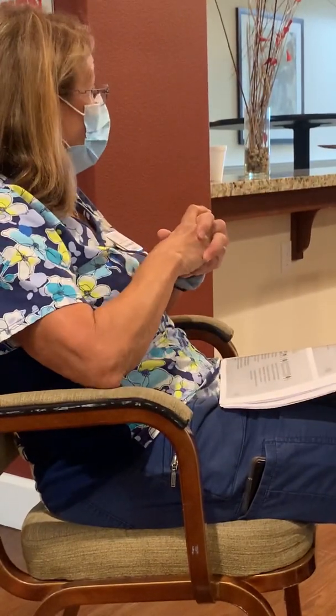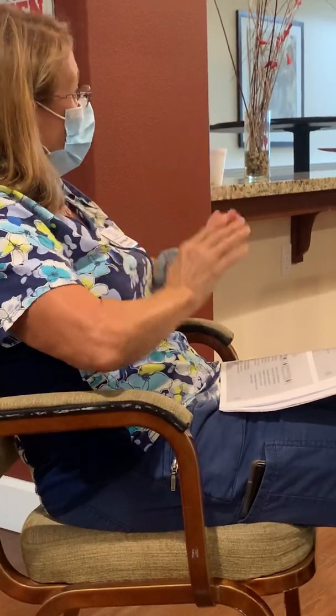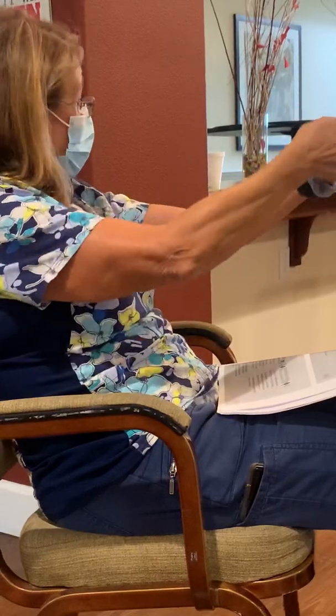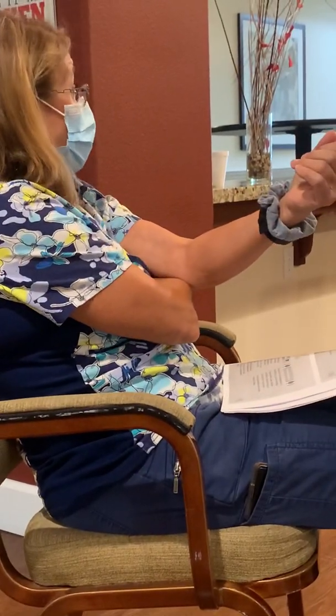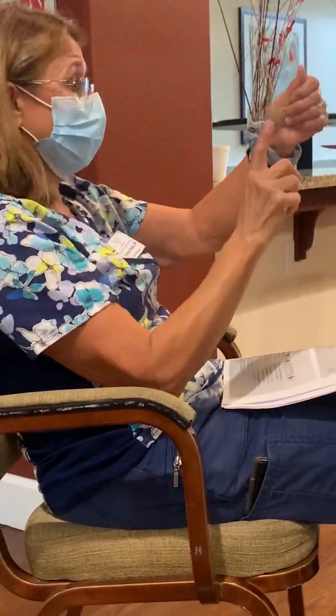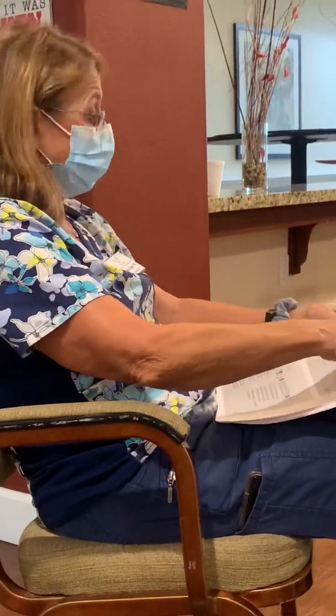Now for a woman, we're gonna clean the perineal area. You're gonna start at the top and work down towards the bottom. You're gonna start at the catheter again, work down towards the end of the tubing. So again, same with the man, do the tubing and down that way in a circular motion all the way down, and then cleaning the perineal area of the woman.